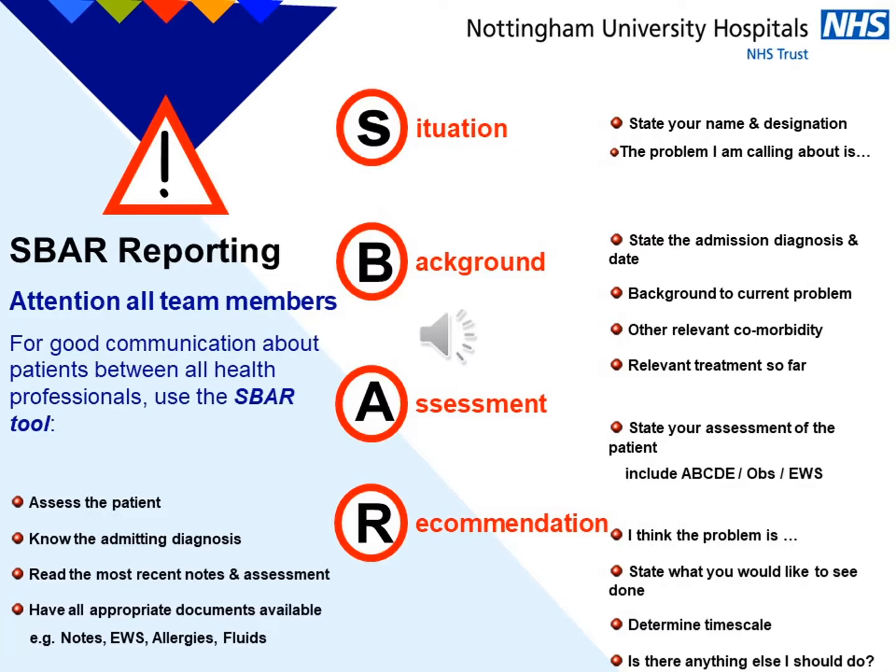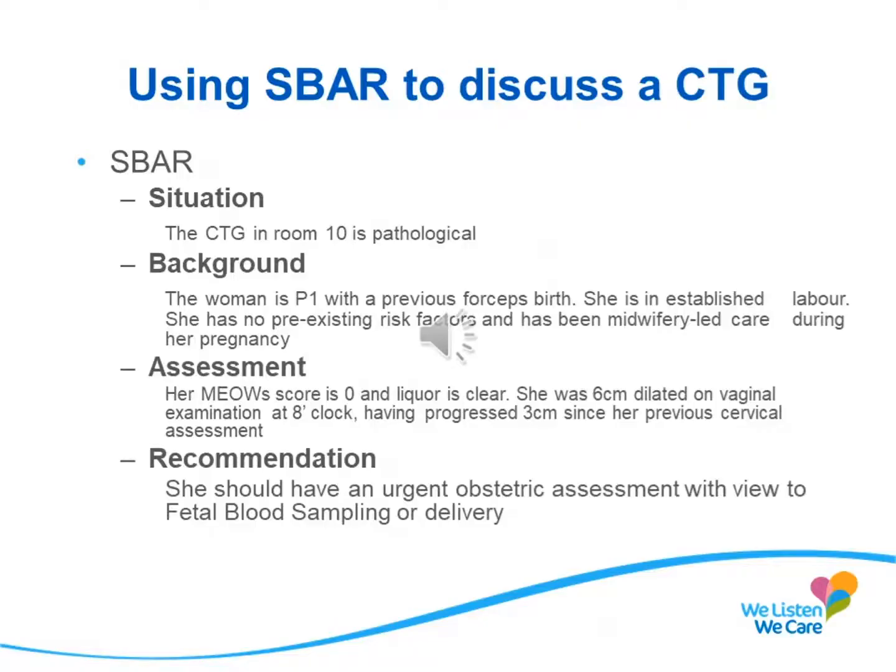The SBAR format lets us organise our communication and convey this clearly to our colleagues. We need to describe the situation, background, assessment and recommendation. This slide gives an example of how you can use SBAR to discuss concerns about a CTG.